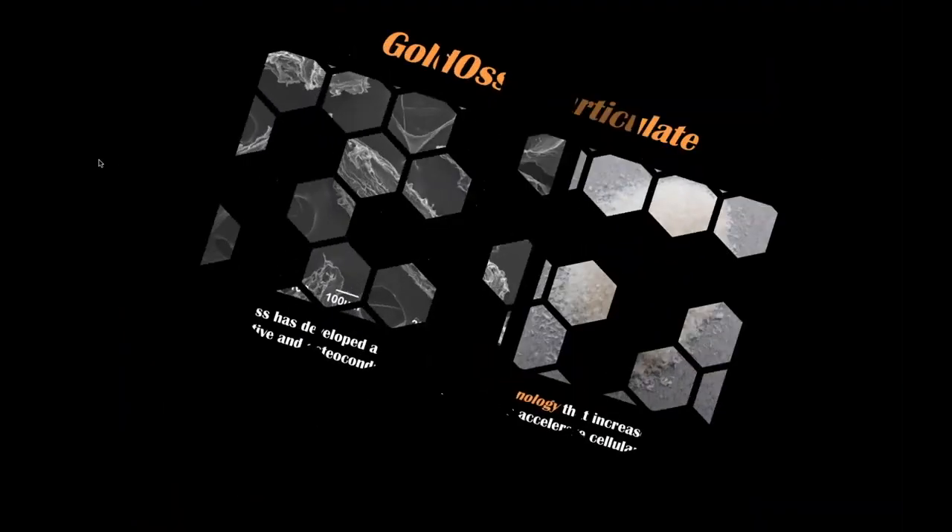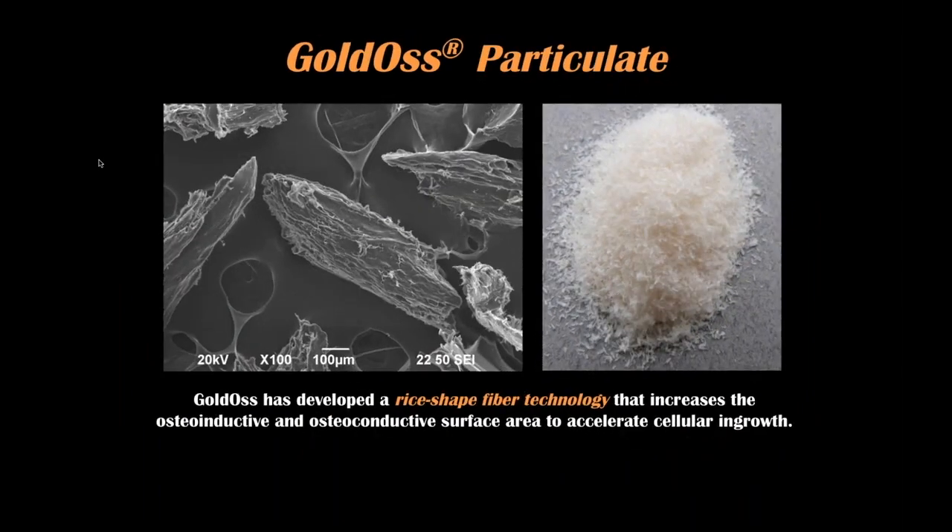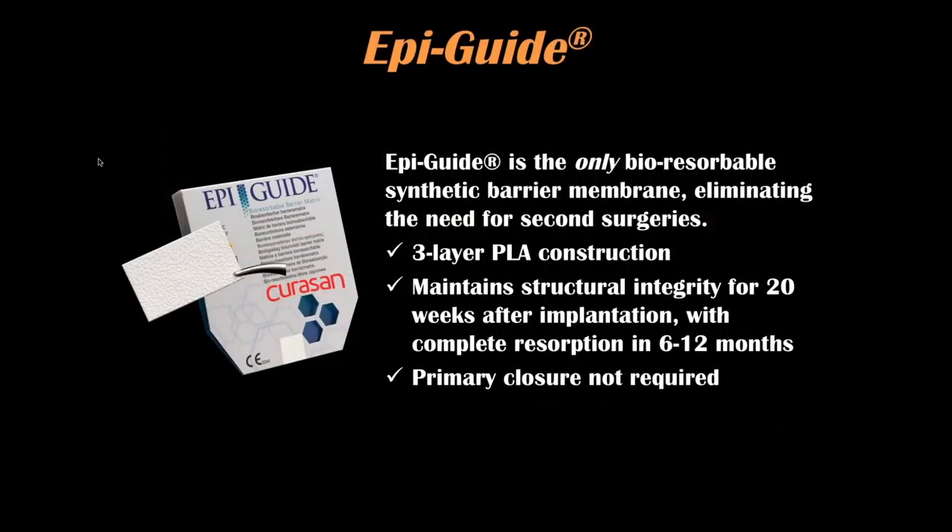The Goldent particulate is an incredibly viable graft material that I strongly recommend — it's very cost-effective. Thank you to Goldent for providing it. The Epi-Guide material is a polylactic acid membrane that lasts six to twelve months, though I only need it to last six weeks.